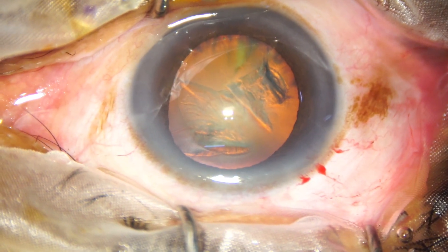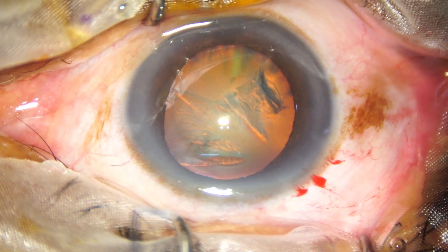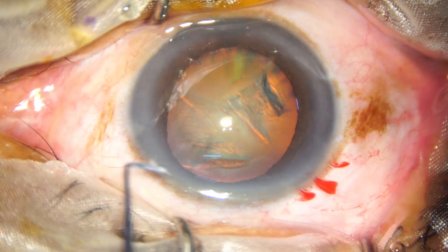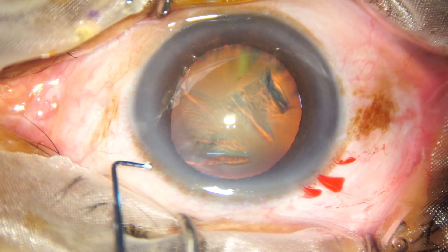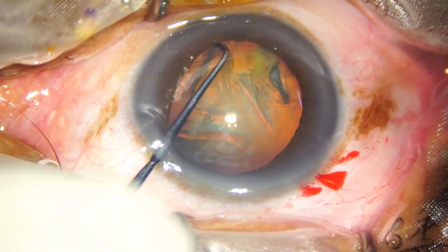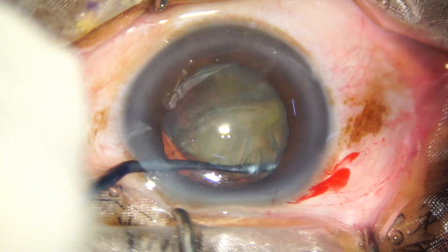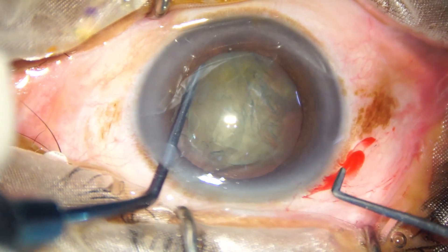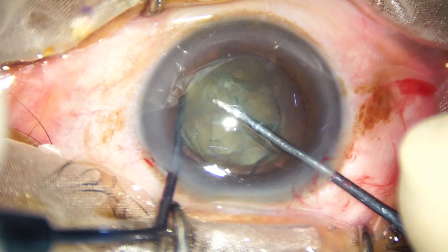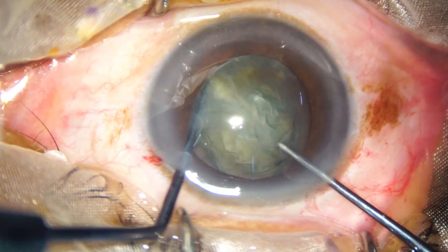In this case, whenever there is floppy iris, I prefer to use my pre-chopper — the pre-chopper designed by me. And this is the nucleus sustainer. It hooks the equator and gives support while this pre-chopper or nucleus cutter goes forward.